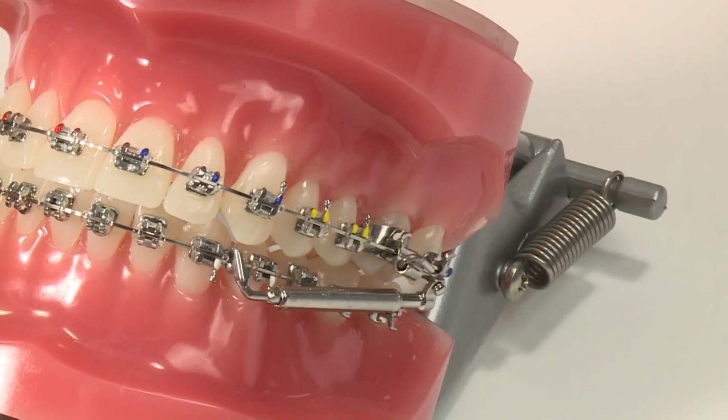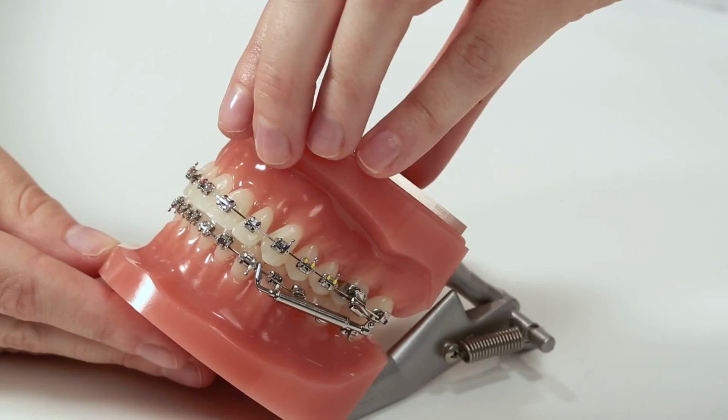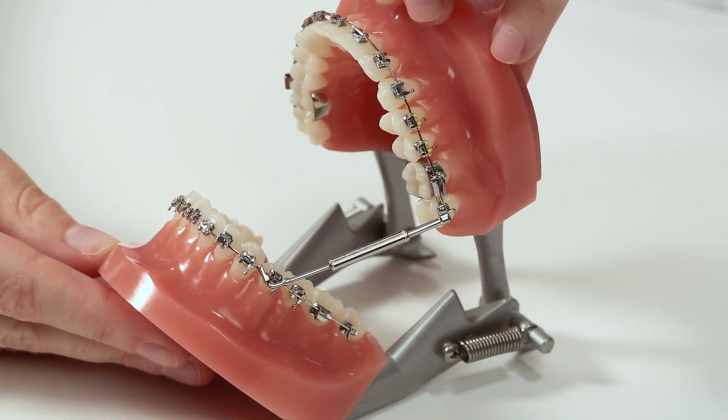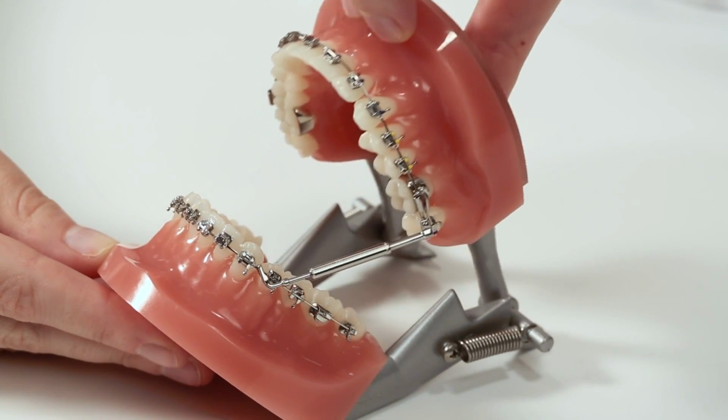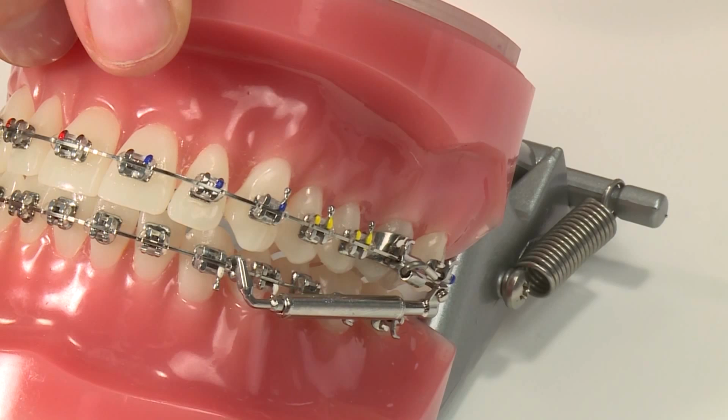Make sure when the patient's mouth is closed that there is about 1 to 2 millimeters of play. You do not want to fully compress the body. In the mouth, push the body to ensure it compresses at least 1 to 2 millimeters.